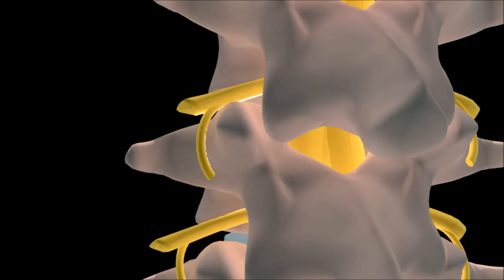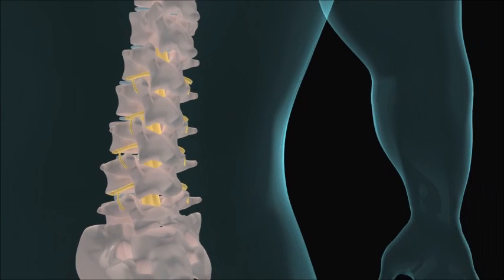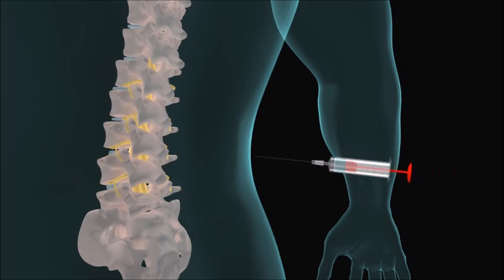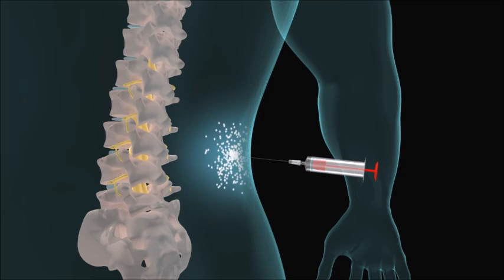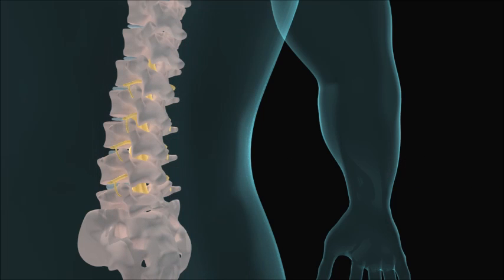Dr. Krishna is highly experienced in performing radiofrequency treatment. The procedure is done under local anesthetic. Dr. Krishna will initially numb the skin and deeper tissues with a numbing medicine.